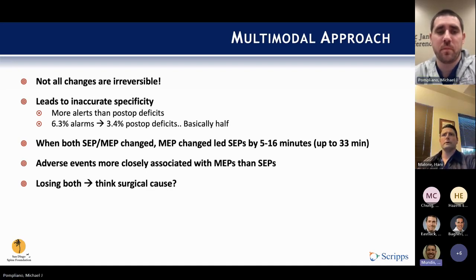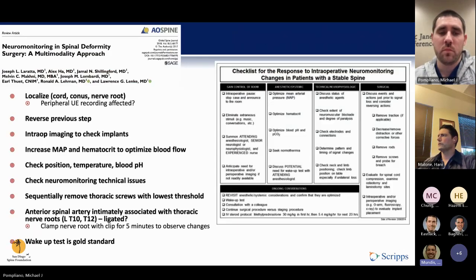Maybe a couple comments. Yeah, I mean, that algorithm is really, really important because it allows you to think through things. If you're working at the same hospital over and over again, I think having that printed out is a good thing, especially if you're doing more high risk cases, because it takes the pressure off you of remembering everything. Because in that heightened state of concern, your brain will sometimes shut down rather than wake up. And so if you have something to lean on, it makes sense, because then you can just start literally one after the other, going through what the potential problems are.